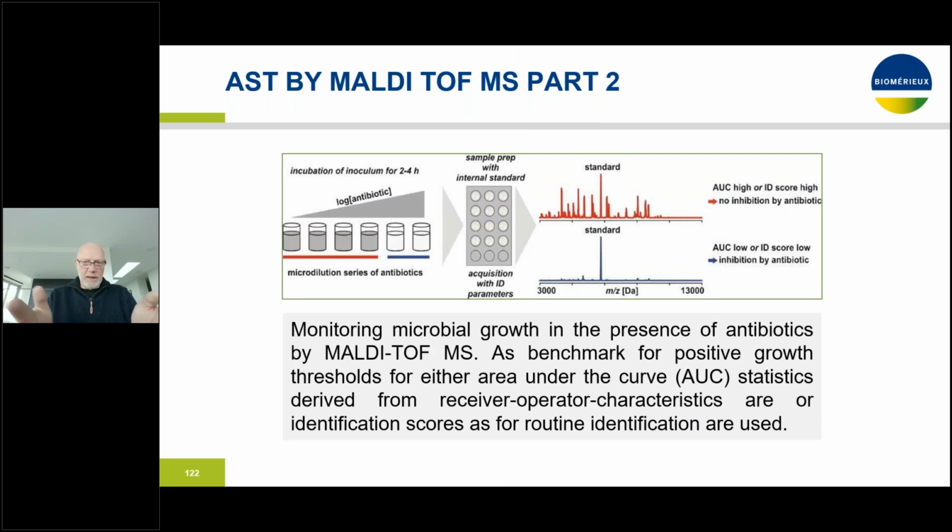There's even, like in this particular slide, methods where if you look at solutions with increasing amounts of antimicrobials with a standard amount of bacteria, you can see whether something is growing in the first dilutions and nothing is growing in the 2 final dilutions where most of the antimicrobials is present. You can even do a quantitative antimicrobial susceptibility assessment.